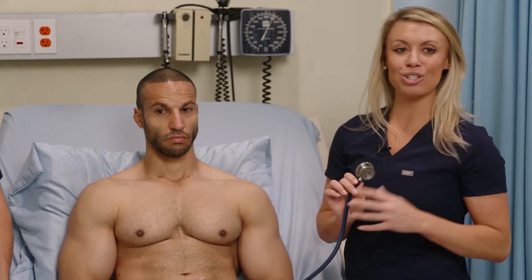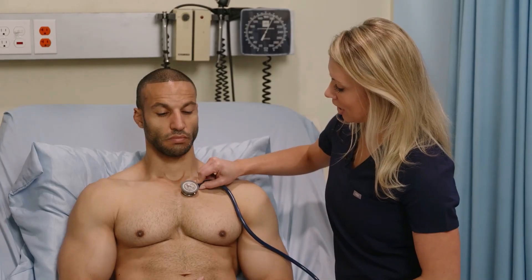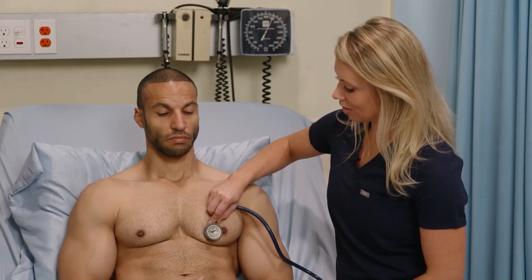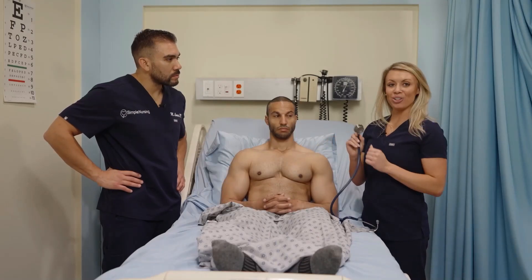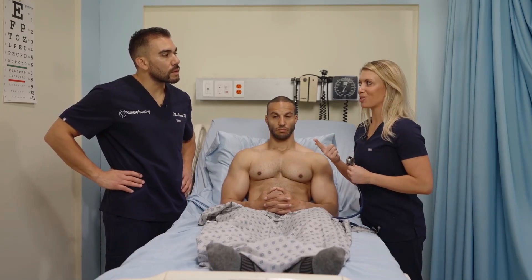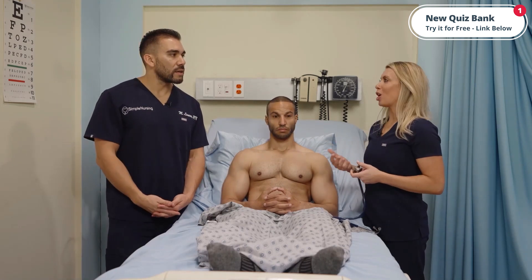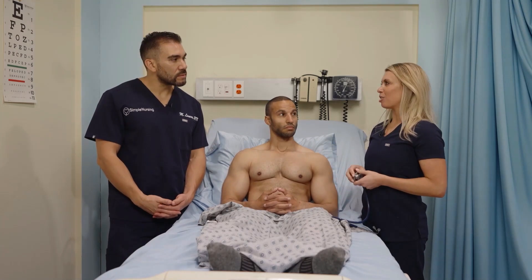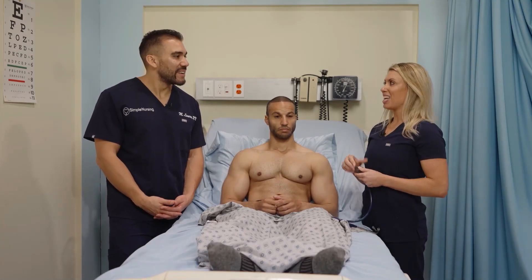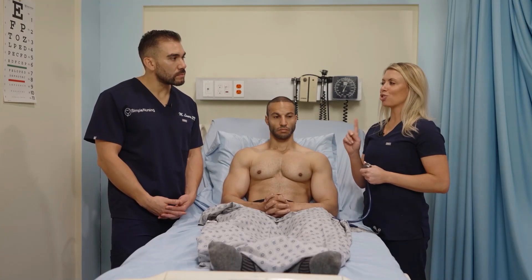Then you click over to your bell and do the same sequence again — aortic, pulmonic, Erb's point, tricuspid, and mitral. This time, since you're listening with the bell, you're listening for abnormal sounds: extra heart sounds or murmurs. A murmur sounds like a swishing, like a washing machine — exam questions often write 'whoosh' or 'swoosh,' indicating turbulent blood flow through the valves.